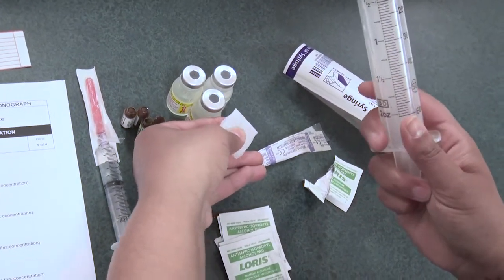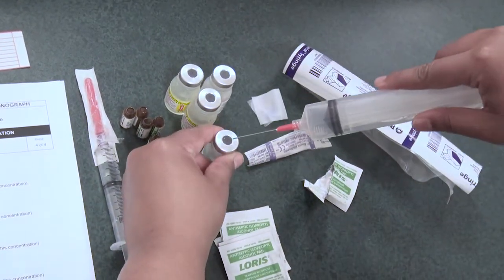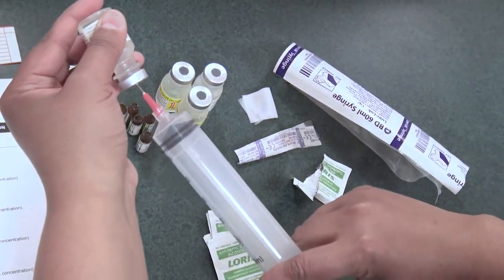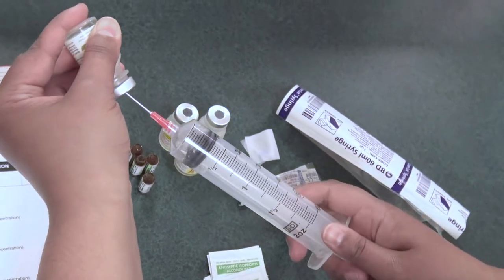I'm going to first inject air into here, and I'm going to continue to do this for all of my salines, until I get 45 milliliters.